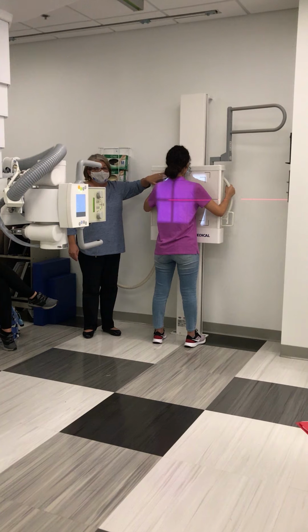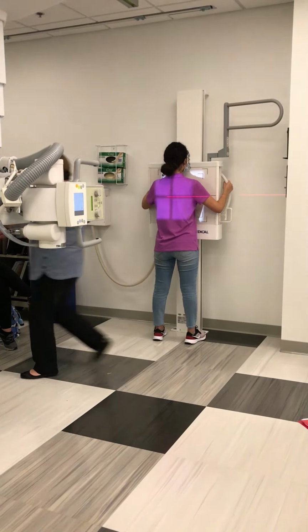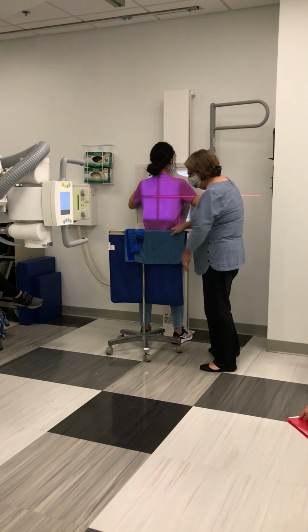That is going to mark my patient's left side. I'm going to roll this shielding over here. Make sure my patient's shielded.